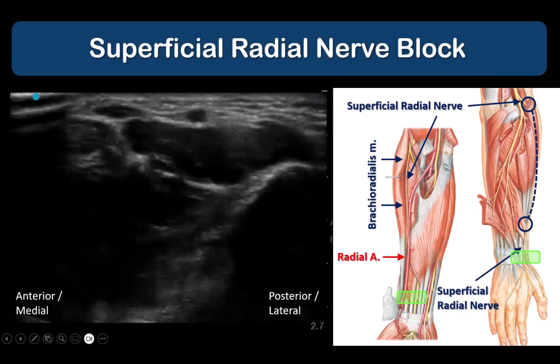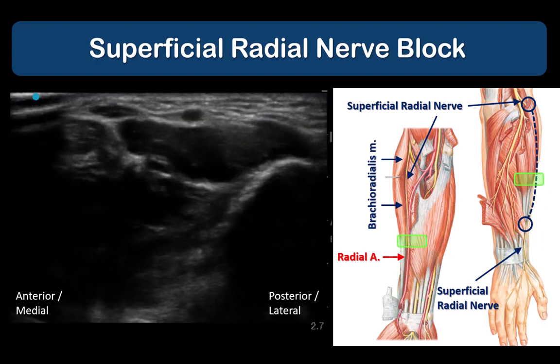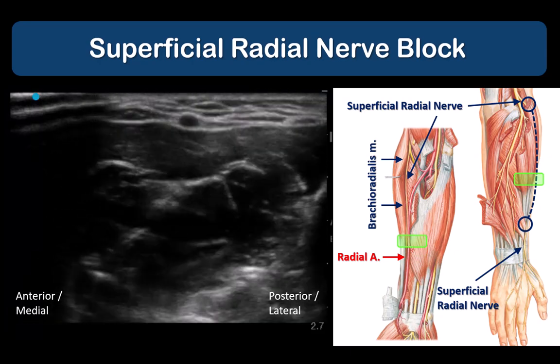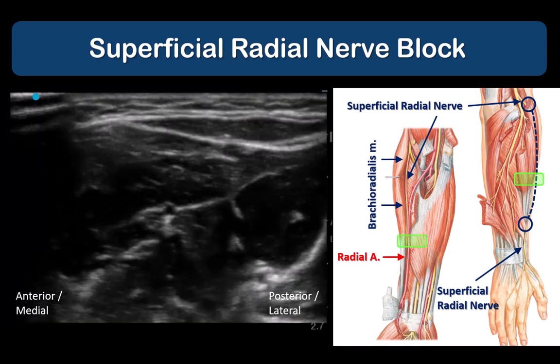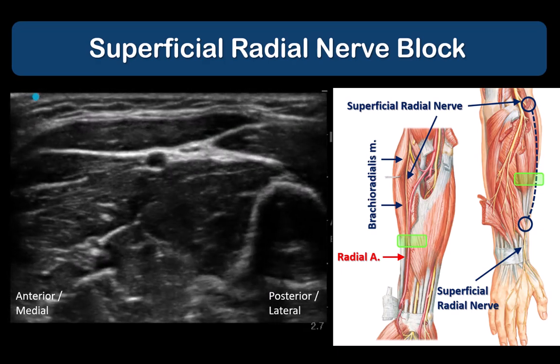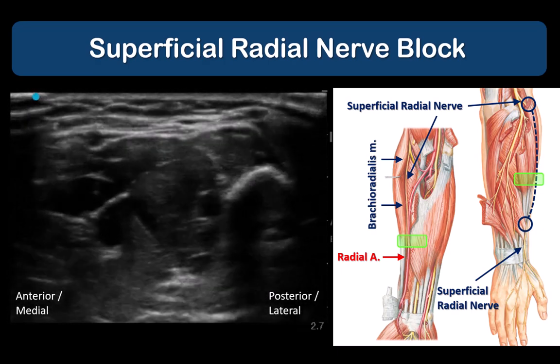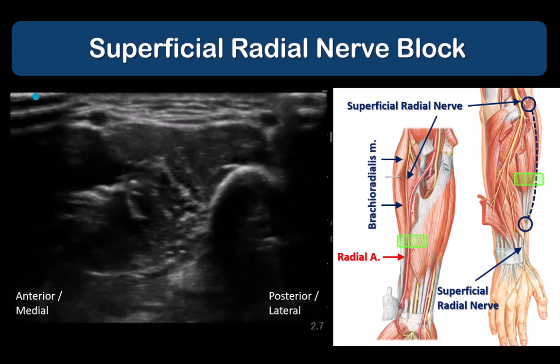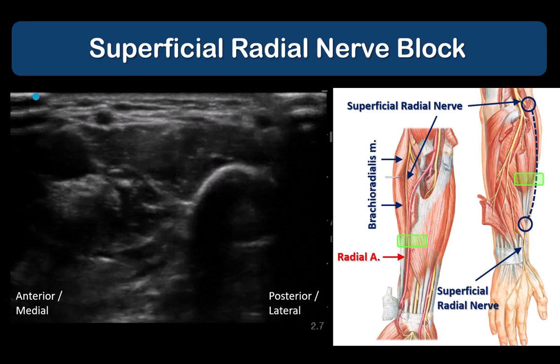In another example, we start scanning over the radial artery at the wrist and trace it proximally, watching for the brachioradialis muscle to expand into its belly. As we do this, we can see the hyperechoic superficial radial nerve sliding medially under brachioradialis towards the radial artery. This back-and-forth scanning can be repeated as needed to clearly identify the nerve.